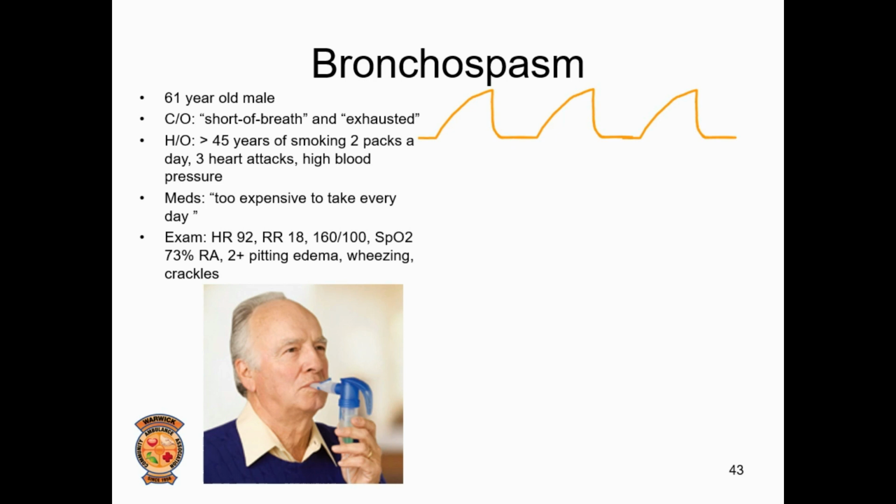The small airways in the lungs become irritated and inflamed due to these triggers. This inflammation results in wheezing, coughing, and shorter breath. Capnography can answer the question of whether it's COPD or CHF for us. We can put the capnogram on the patient, and if he has a shark fin waveform, as you can see here, we can treat the patient for his COPD with bronchodilators.